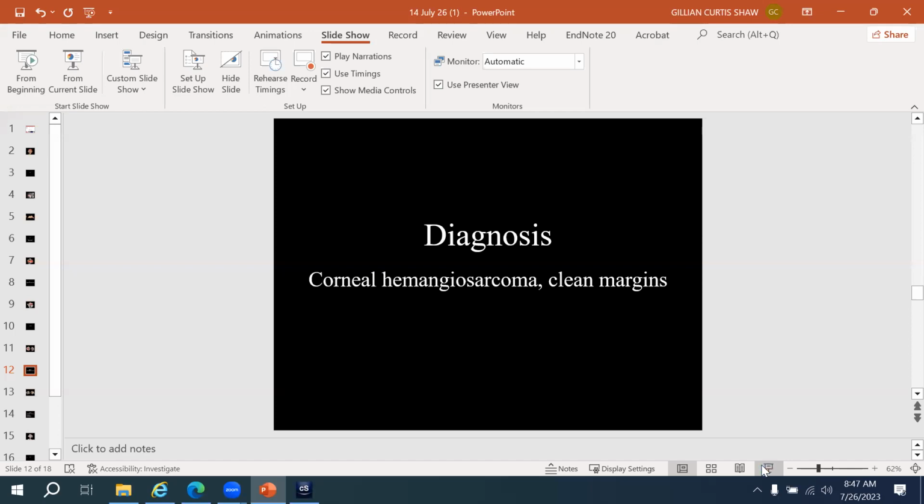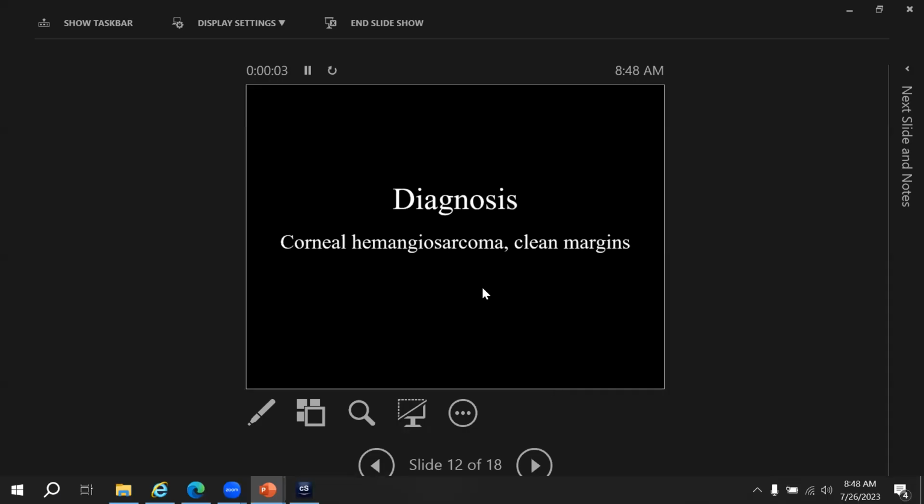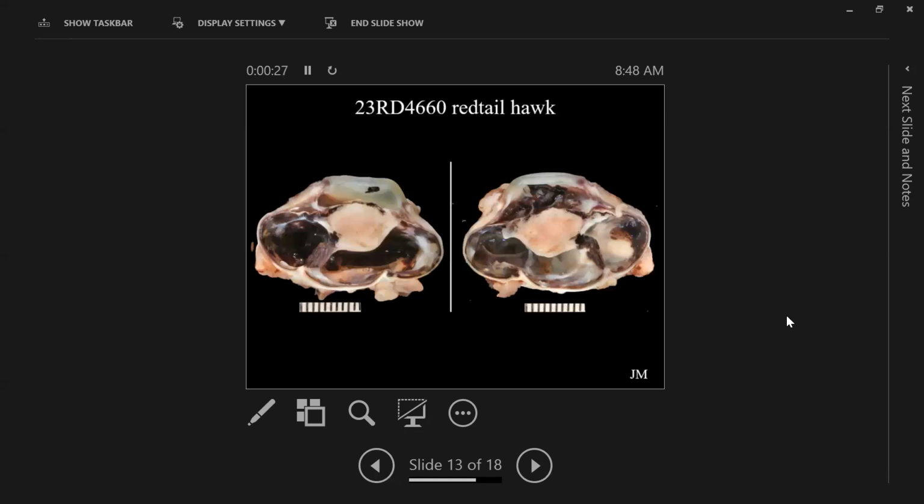The cornea rarely develops any kind of actinic change that I've ever recognized. So solar elastosis is very rare in the cornea, which is perhaps a good thing, because otherwise we would all get it by the end of our lives and not be able to see anything. All right. Somebody just said that in the chat. Like, does that happen in the cornea? Okay. Pre-answering questions. Get the little magic 8 ball.